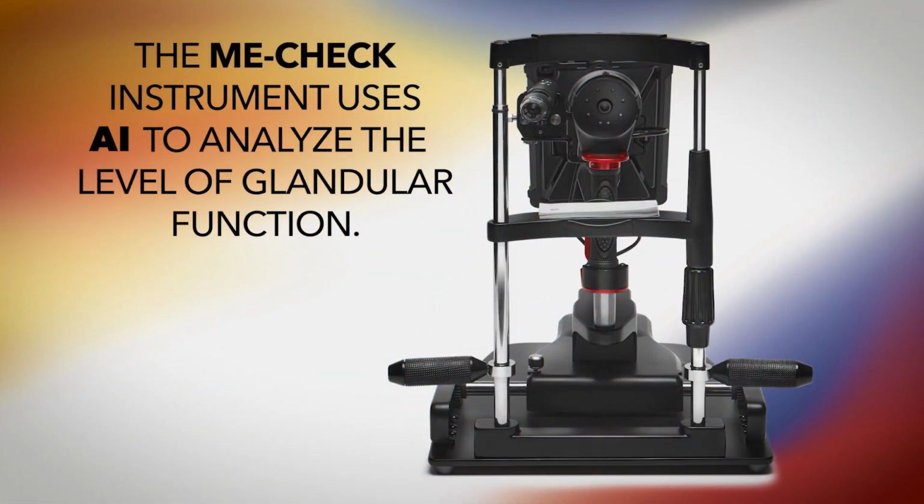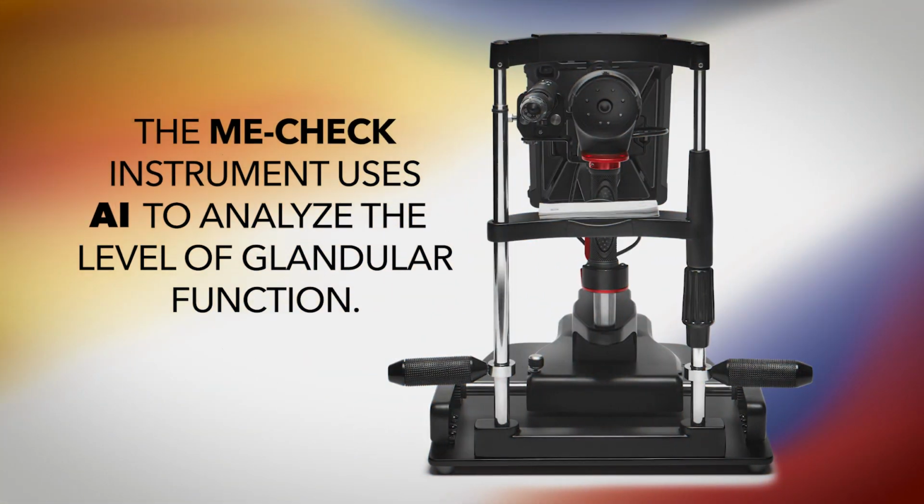The beauty of this is that the instrument will look at that whole area that I've imaged, and it will do an analysis from the nasal component to the temporal component, and it will tell us what the level of glandular function is, or actually how well they look, because there's AI built into this.